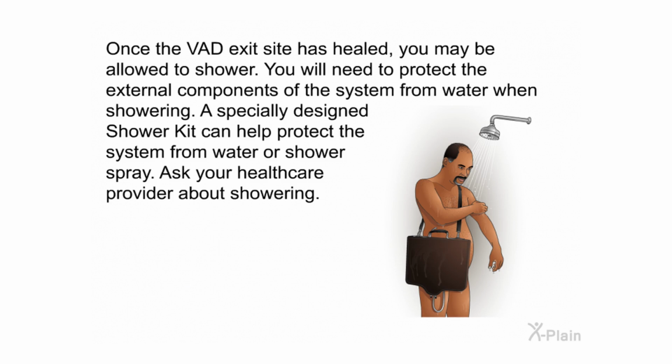Once the VAD exit site has healed, you may be allowed to shower. You will need to protect the external components of the system from water when showering. A specially designed shower kit can help protect the system from water or shower spray. Ask your healthcare provider about showering.